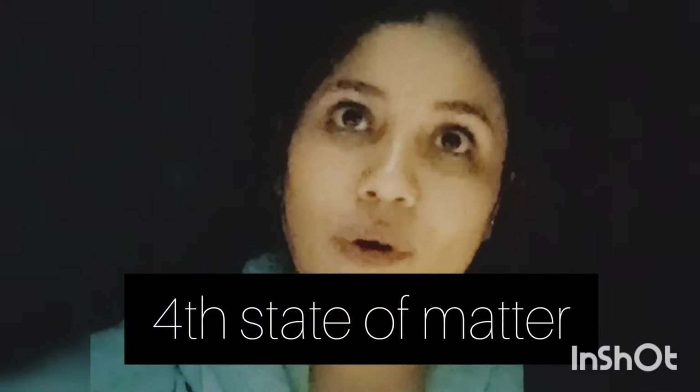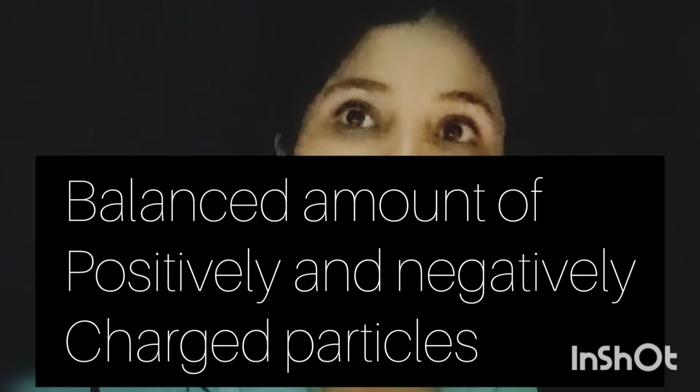You might be wondering what is gas plasma and what is plasma. Plasma is the fourth state of matter. The other states of matter are solid, liquid and gas, and the fourth state is plasma. It contains a balanced amount of positively and negatively charged particles, so it is an ionized gas. Ionized gas means it contains charged particles. This is the main important point of plasma.